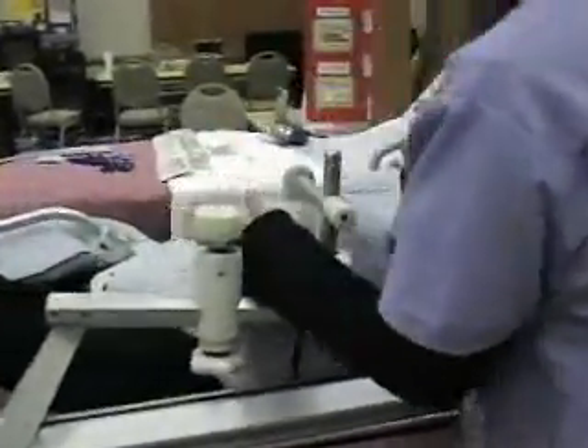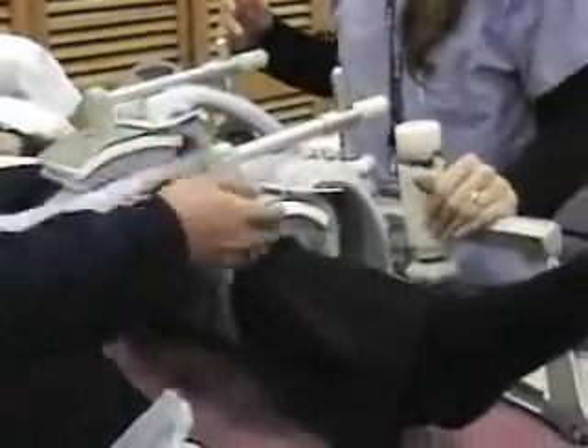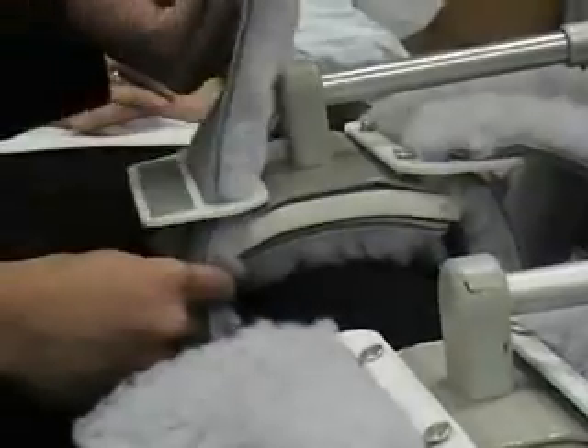Put the slings on. Place the calf sling so it corresponds to the bulk of the calf — be gentle with a patient who just had knee surgery. When you clip it into the pegs, make sure there's a one-to-two finger breadth space between the pedal and the strap. That's very important. Then do the same for the thigh sling — snap it into the peg and adjust for one-to-two finger breadths.